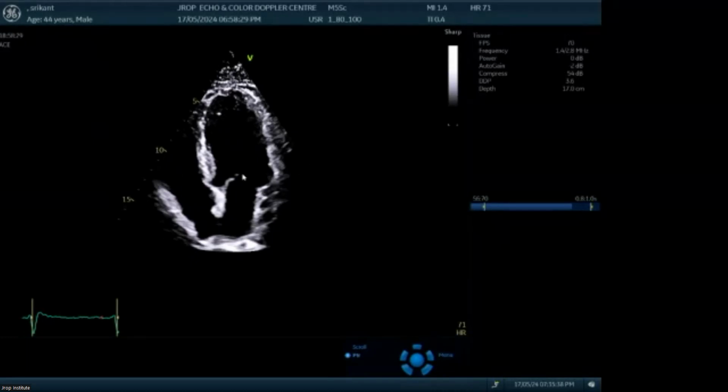Another thing, sir: while calculating this area for mitral stenosis, what will be more specific, mitral valve area by pressure half time or mitral valve area by planimetry? Remember the simple principle: mitral valve area always by planimetry. Whatever happens, when the hole is small and you can measure the size of the hole, why do you want pressure half time? Okay.